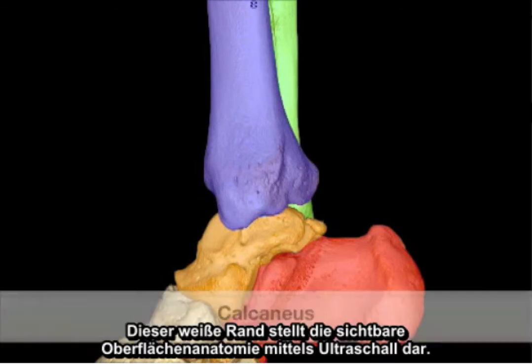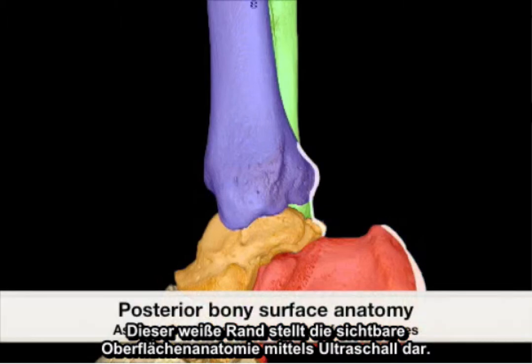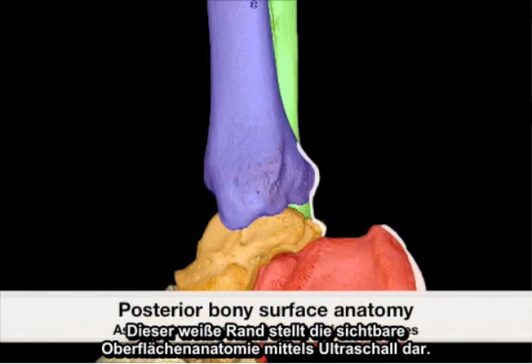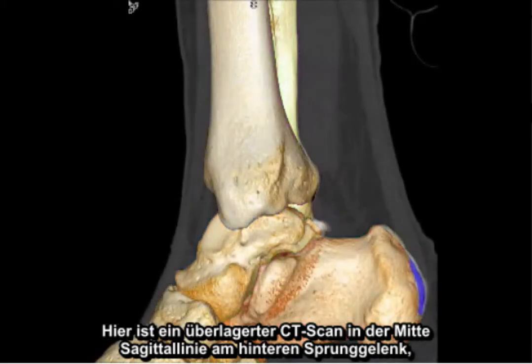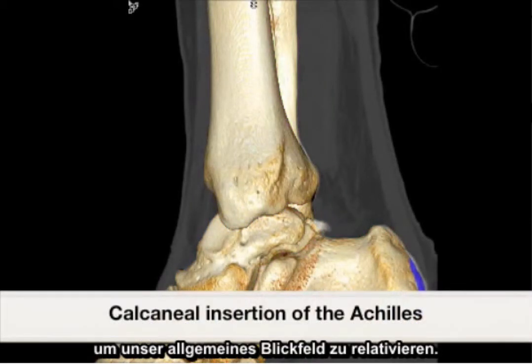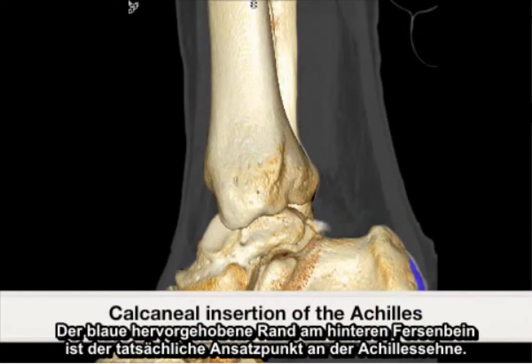This white rim represents the viewable surface anatomy by ultrasound. Here is a superimposed CT scan at the mid-sagittal line at the posterior ankle to put into perspective our general field of view.